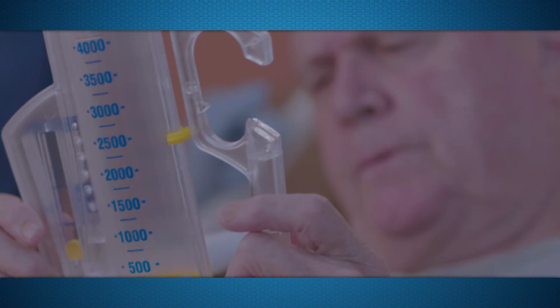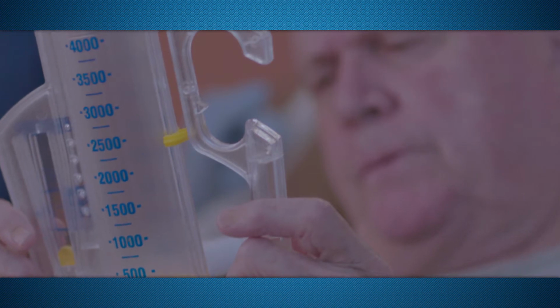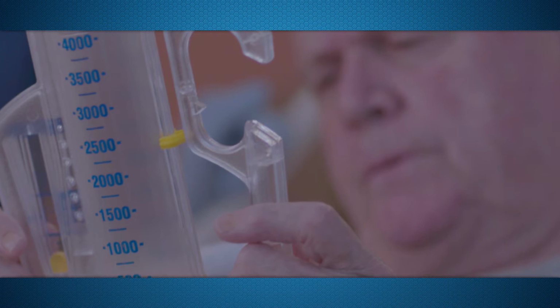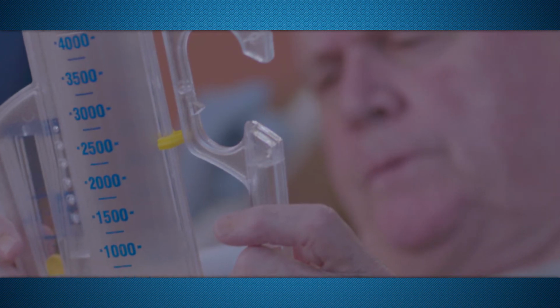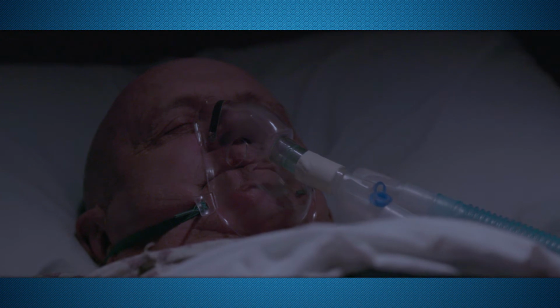Oxygenation consists of two types of tasks. The first enhances the patient's natural breathing pattern, such as positioning, deep breathing, coughing, and the use of an incentive spirometer. The other task includes the direct administration of oxygen.